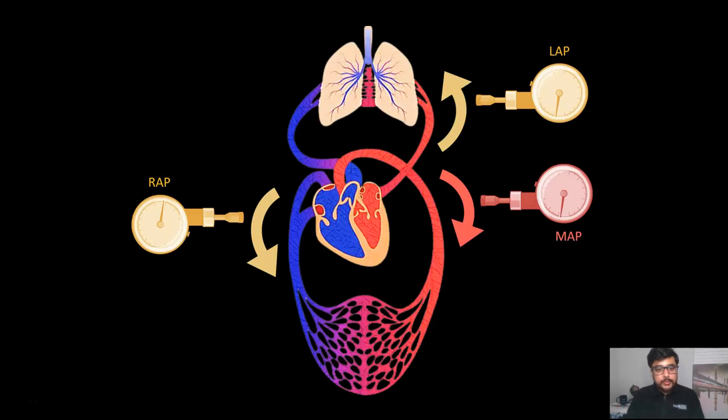When assessing a patient's hemodynamics at the bedside, we pay attention to three important components of the hemodynamic circuit. First, we want to make sure the forward limb of the hemodynamic circuit is good, meaning the stroke volume, cardiac output, and mean arterial pressure are adequate. And then you look at the backward effects of elevated cardiac pressures. For example, elevated left atrial pressures are manifested in the form of elevated extravascular lung water. And elevated right atrial pressure is transmitted backwards into the organs, leading to congestive organ injury.